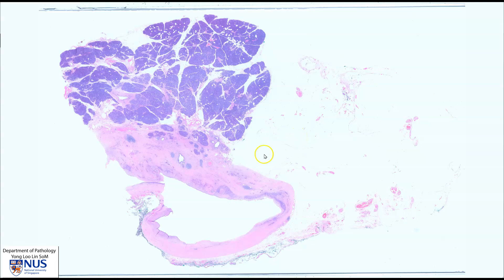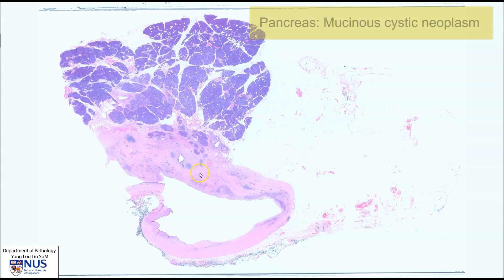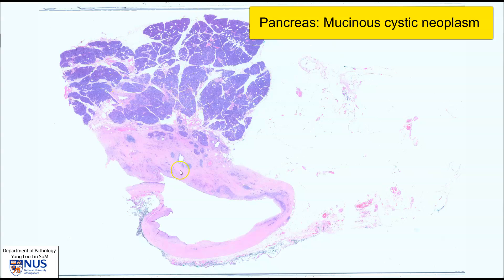Hello, this is a virtual microscopy slide of a mucinous cystic neoplasm of the pancreas. At low magnification, here is the benign pancreatic parenchyma, and this is the cystic tumor, and here is some peripancreatic fat.